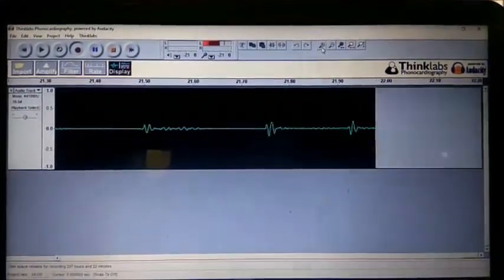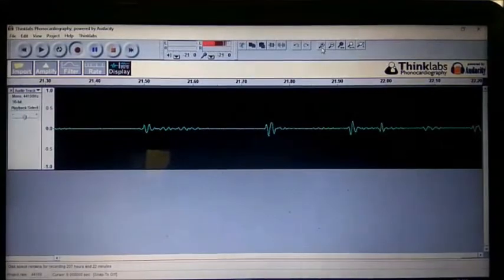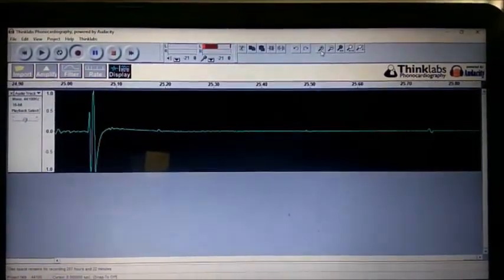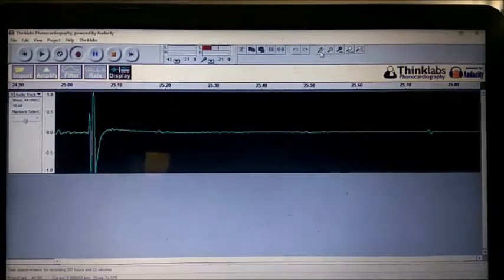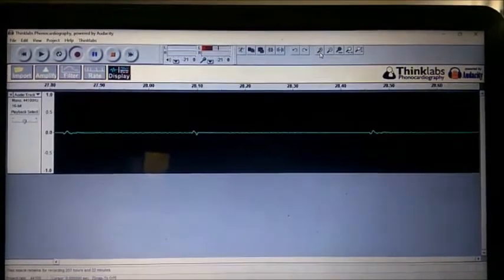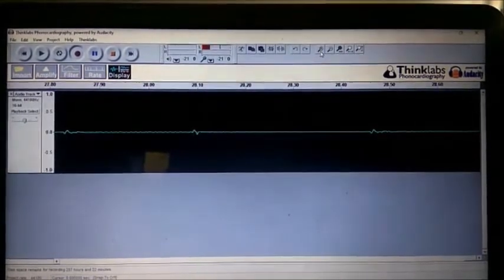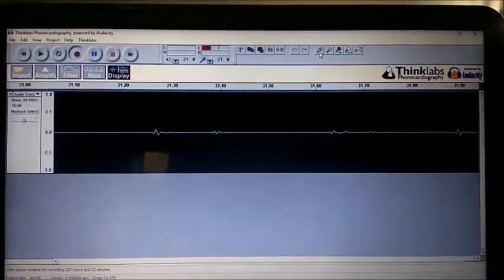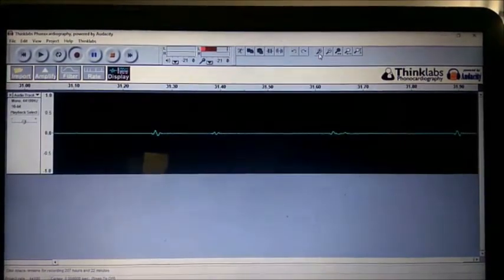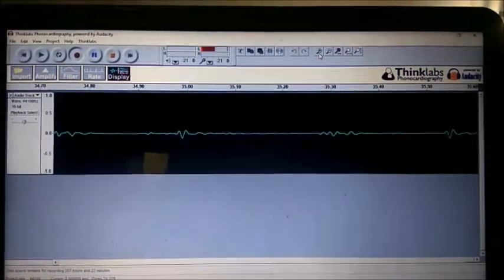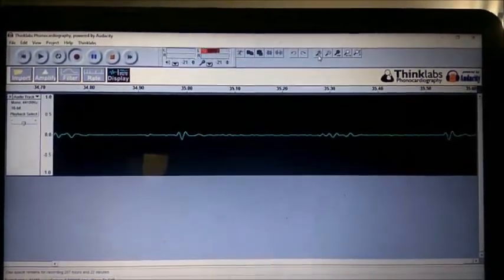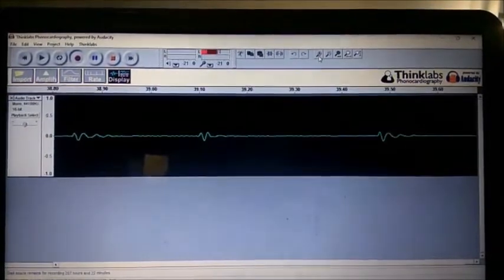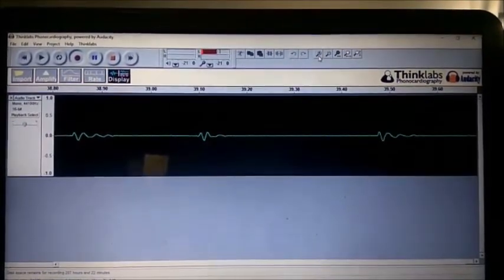This is the phonocardiogram pulse in diaphragm mode. This is the phonocardiogram pulse in wide mode. This is the phonocardiogram pulse in bell mode.